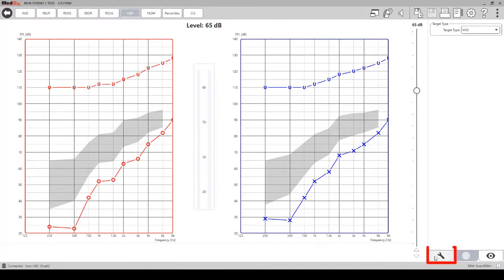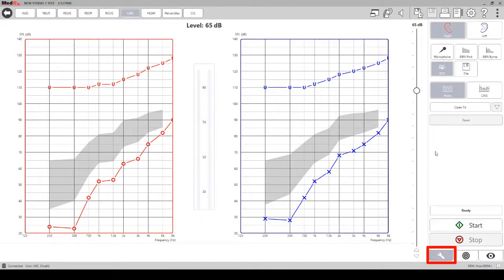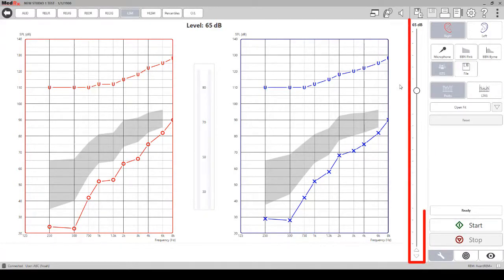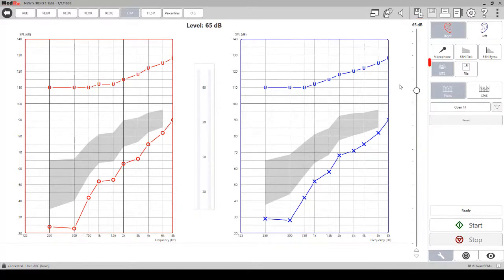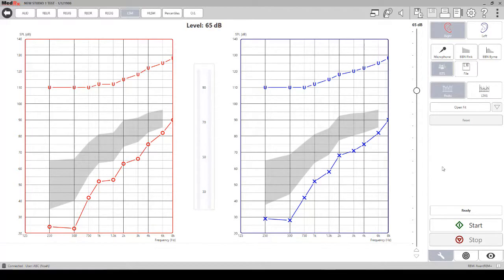From here you can go back to the wrench tab and you can change the intensity of the stimulus that you want to present. For live speech mapping, it is typically run using the ISTS stimulus. To begin taking measurements, click the start button.